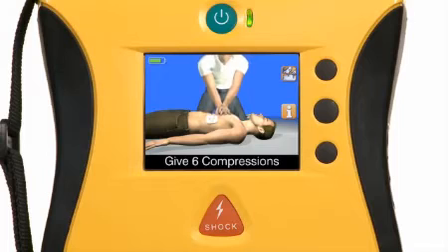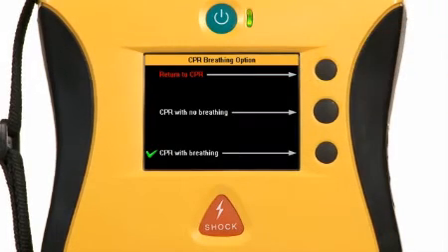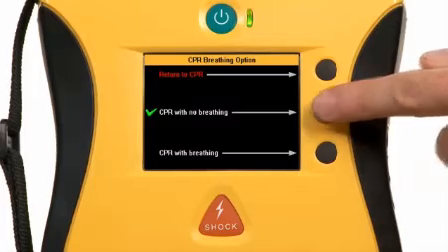And since not all rescuers are the same, there's real time protocol selection. So if you're a trained user who knows how to do both compression and rescue breathing, no problem. Just switch over to doing both without missing a beat. If you're uncomfortable with rescue breathing, then simply choose compression only CPR.